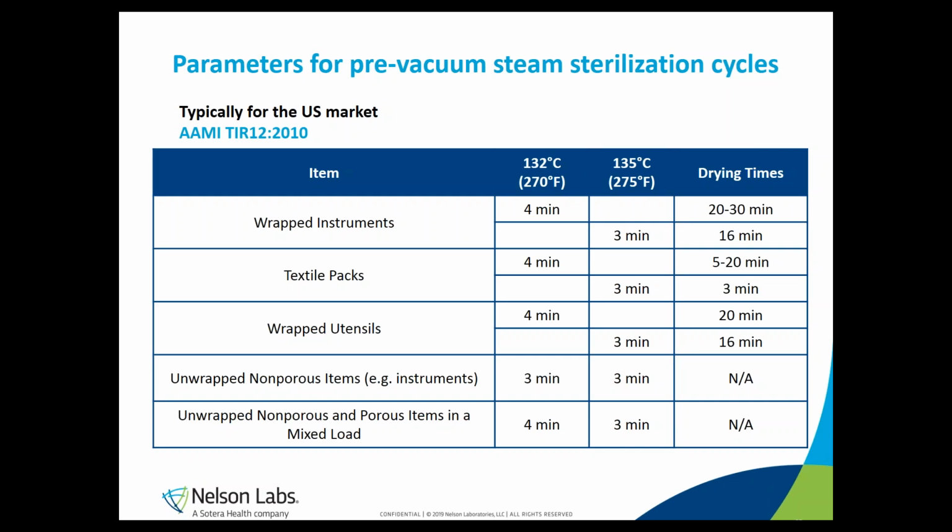Here in this slide, you can see the parameters for pre-vacuum steam sterilization cycles that are typically used in healthcare facilities in the US. These are also listed in the TIR 12 guidance document version of 2010.